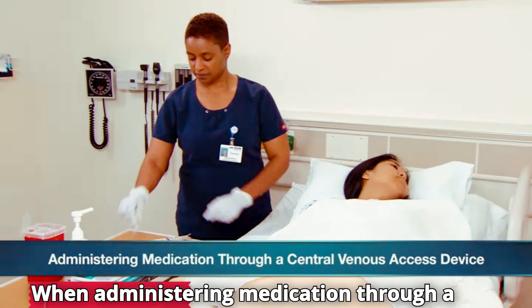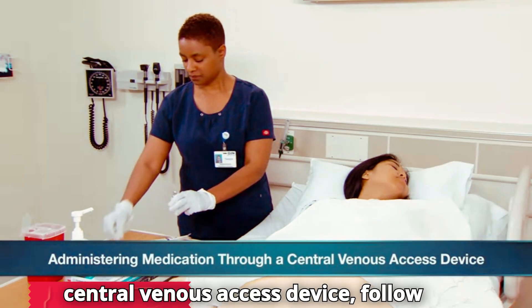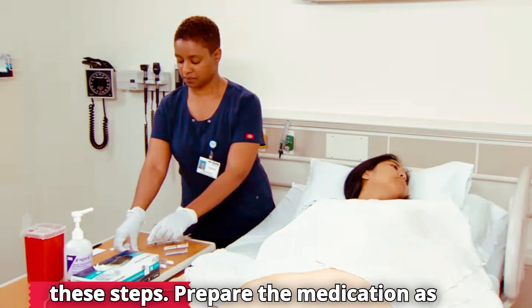When administering medication through a central venous access device, follow these steps.